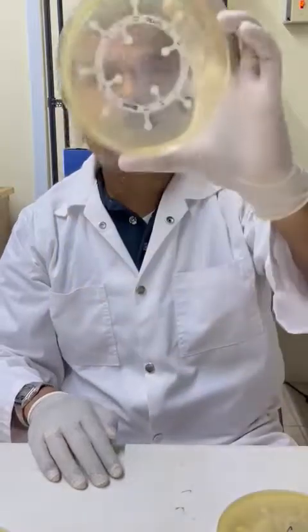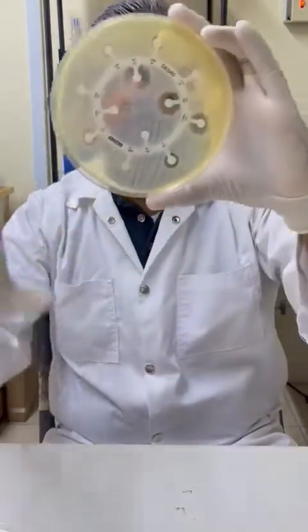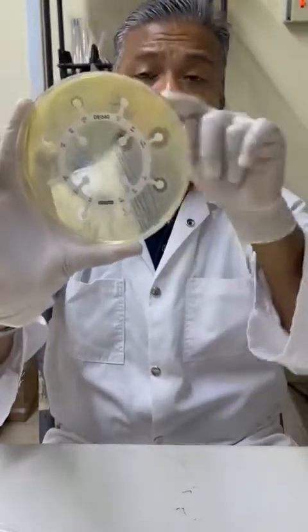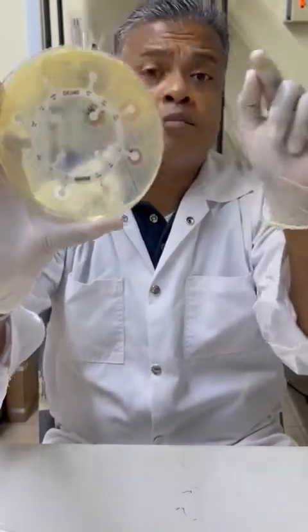In this patient, we've got resistant to Septra, resistant to ciprofloxacin, and resistant to Augmentin, right? These names are commonly used in the medical industry and diagnostic support for patients. This patient as well, resistant to cotrimoxazole, one of the organisms here, there was a mixed organism unfortunately, resistant to cotrimoxazole or Septra, resistant to ciprofloxacin, and resistant to Augmentin.